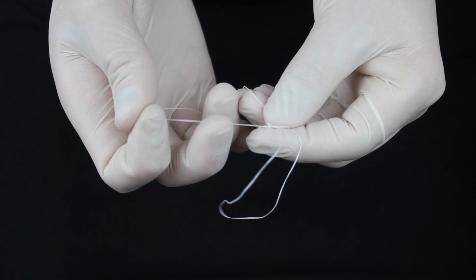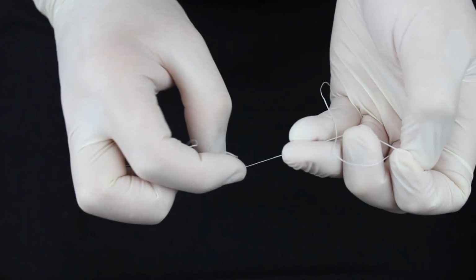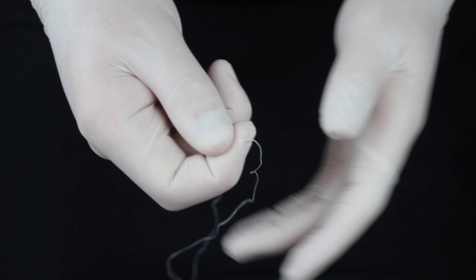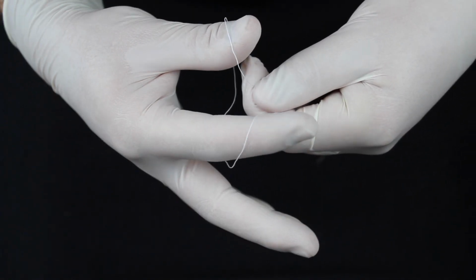If you did it correctly, it should allow tightening, and it should untie itself when you pull strongly on both ends. The second one is a bit trickier to tie. It's called the double loop. You start the same as with the simple loop.